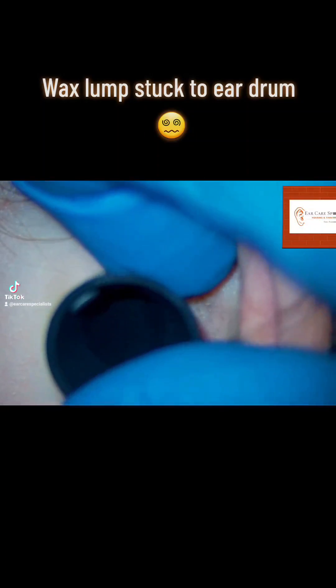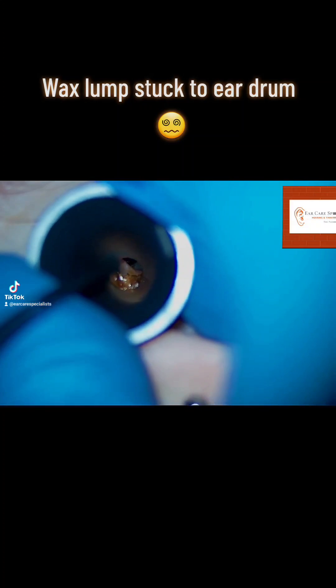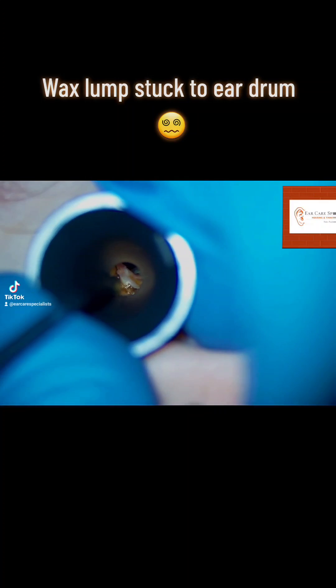Hi folks, Dr. Jeff from Ear Care Specialists here in Nottingham. Thanks for joining me. This patient attended for routine wax removal and as you can see here there's some skin debris and wax just at the start of their ear canal.